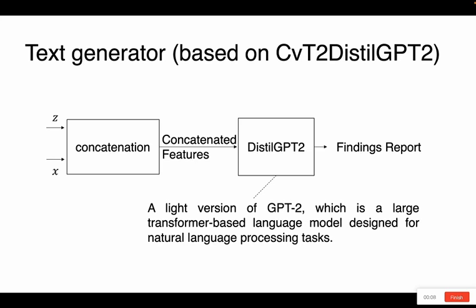When employing CvT2DistilGPT-2 as the baseline, we follow their method to use DistilGPT-2 to generate radiology reports. It's a light version of GPT-2, which is a large transformer-based language model designed for natural language processing tasks.